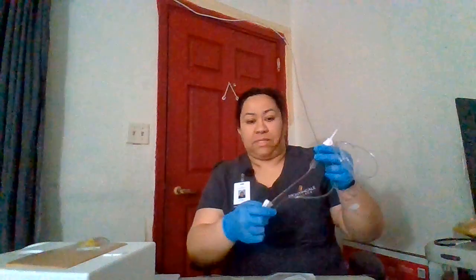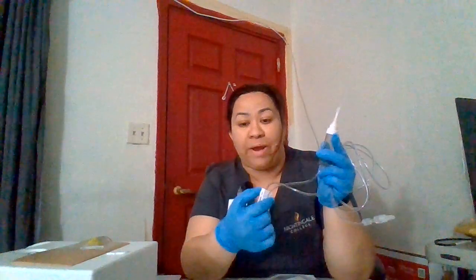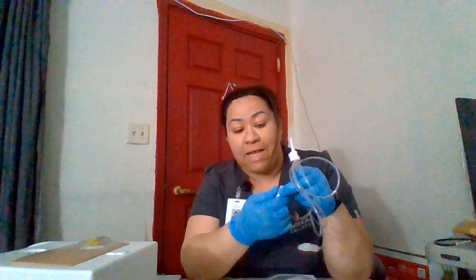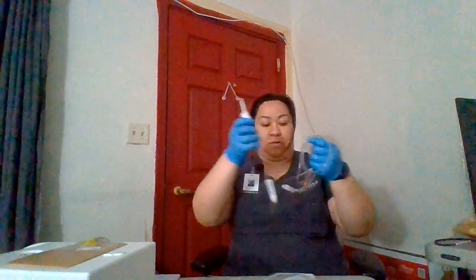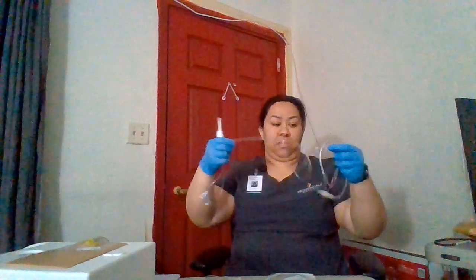The next part is the roller clamp. The roller clamp is actually what allows us to regulate the flow. I will be closing the roller clamp just because I don't want any of the medication to drip out. So it's in a closed position now. Down, then this is the Y connector.